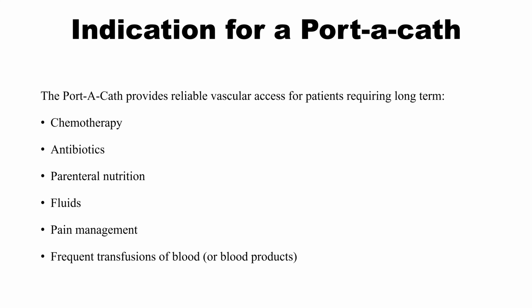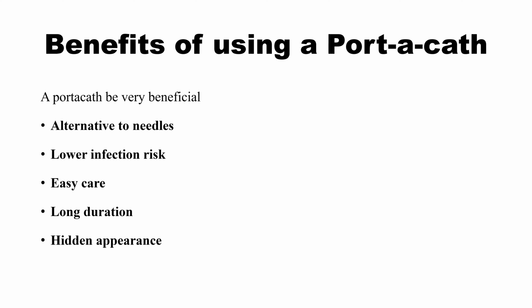Indications for a Portacath. A Portacath provides reliable vascular access for patients requiring long-term chemotherapy, those who need antibiotics, parenteral nutrition, fluids, pain management and frequent transfusion of blood or blood products.